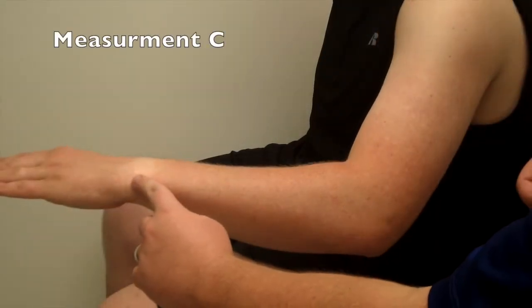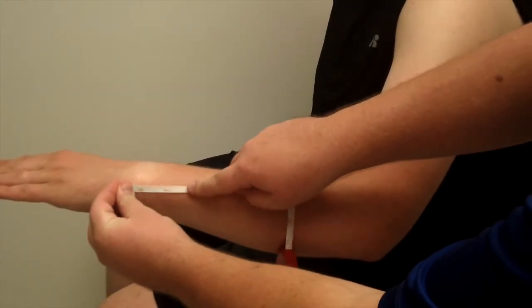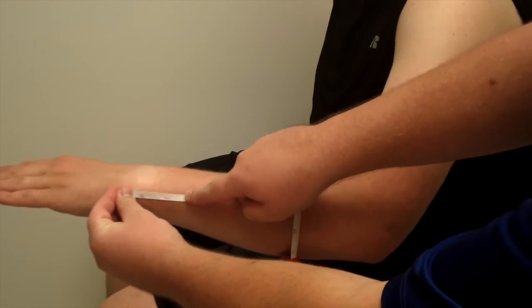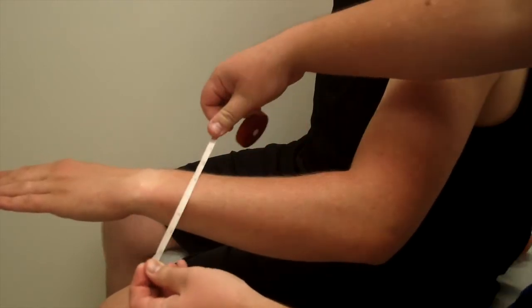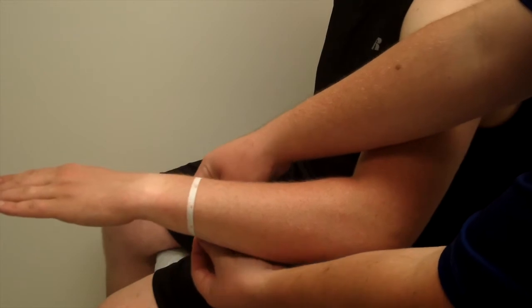Measurement C. Find the ulnar styloid, which is the wrist bone on the pinky side of the wrist, and measure one and a half inches proximally. From that point, take a circumferential measurement.